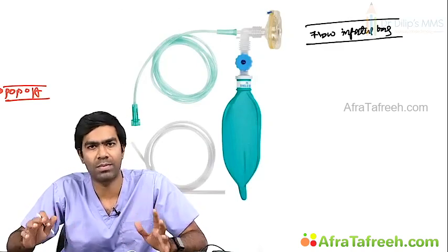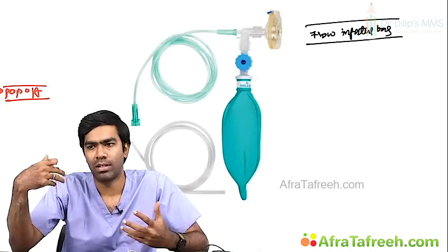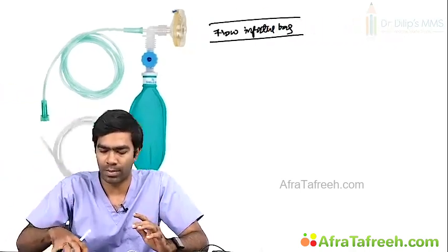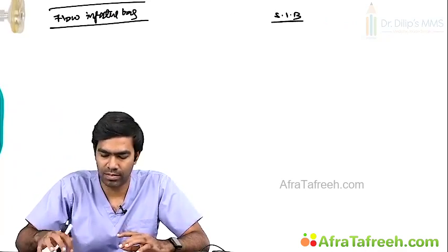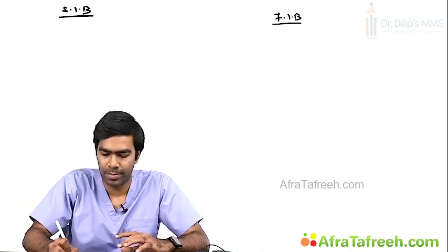So you have a lot of types of flow inflating bag. With flow inflating bags itself, you can give a PEEP. How the gases are getting filled, it's again a long shot. But you need a lot of expertise to use flow inflating bags. Let me tell you the differences between a flow inflating bag and a self-inflating bag. So, I can write self-inflating bag here and flow inflating bag here.